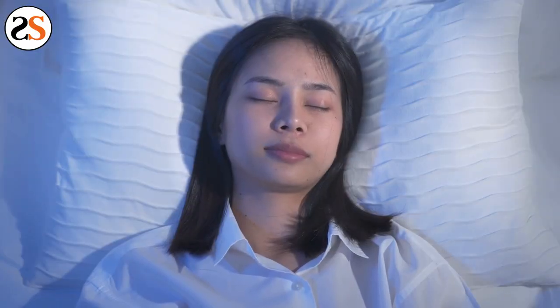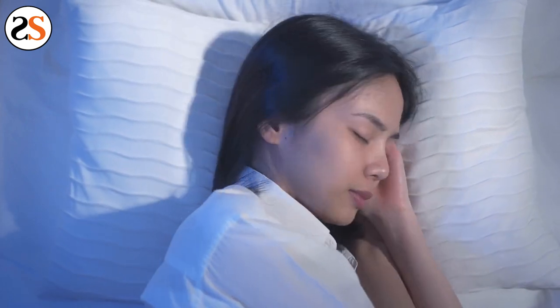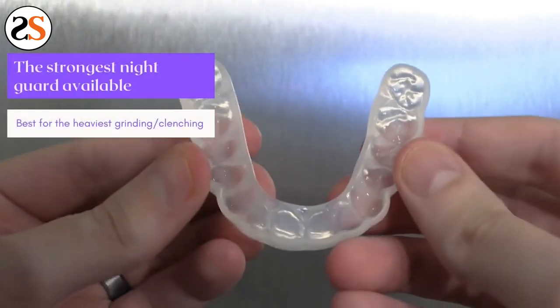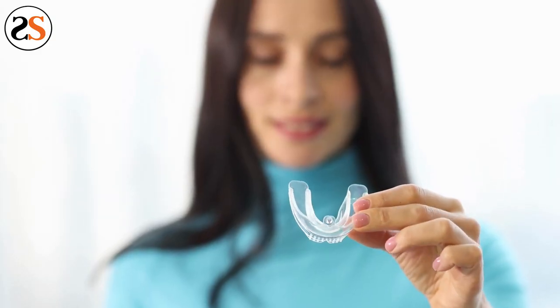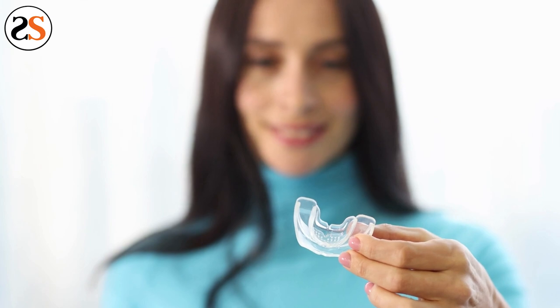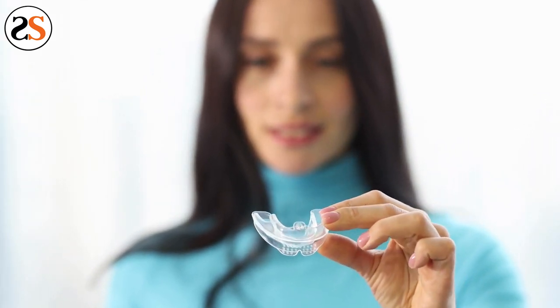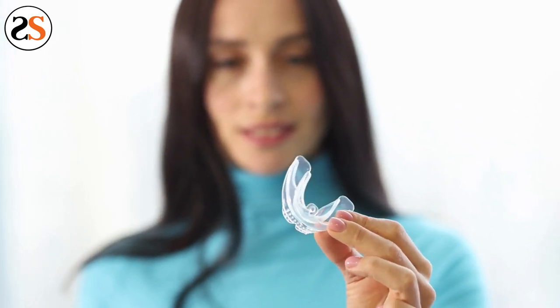By wearing a night guard for TMJ, you are protecting yourself from the harsh symptoms associated with TMJ and clenching your teeth. The best type of night guard for TMJ is a custom-made one. There are plenty of cheap night guards you can find at your local drugstore, but these are boil-and-bite and the durability and protection come into question. You'll have to continue to buy them every few months.